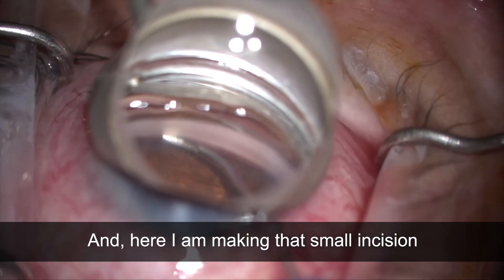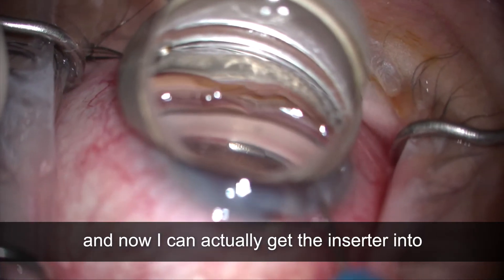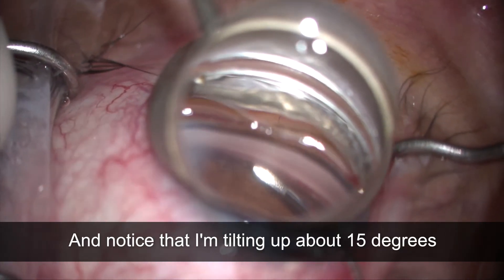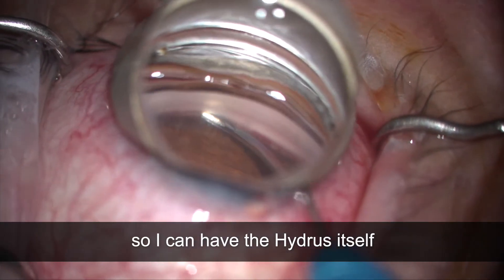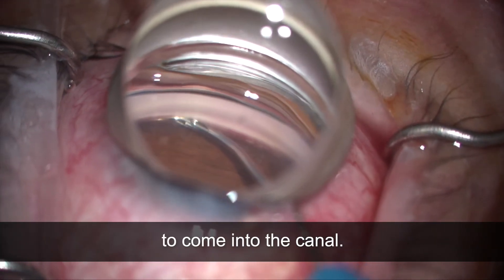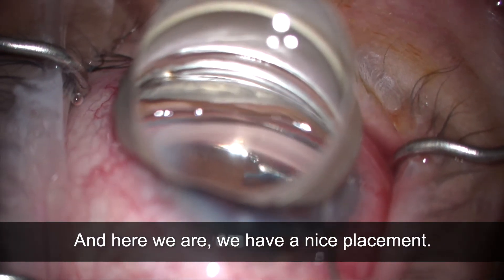Here I am making that small incision, and now I can get the inserter into the canal of Schlemm through the trabecular meshwork. Notice that I'm tilting up about 15 degrees so the Hydrus itself can use the scleral shelf as a guide to come into the canal. You can see it goes in very smoothly — we have a nice placement.